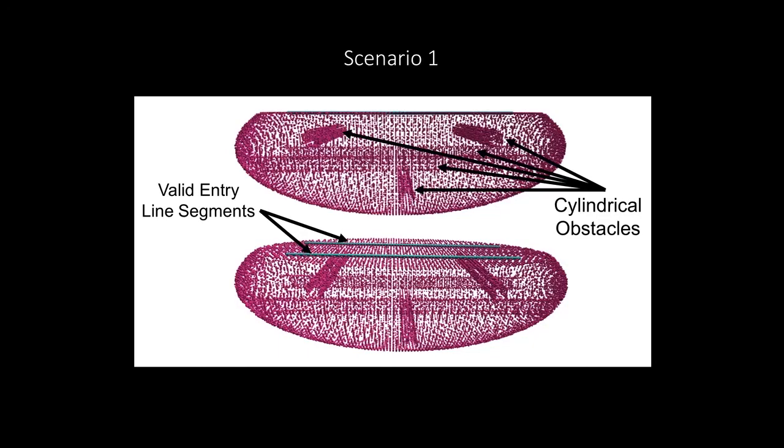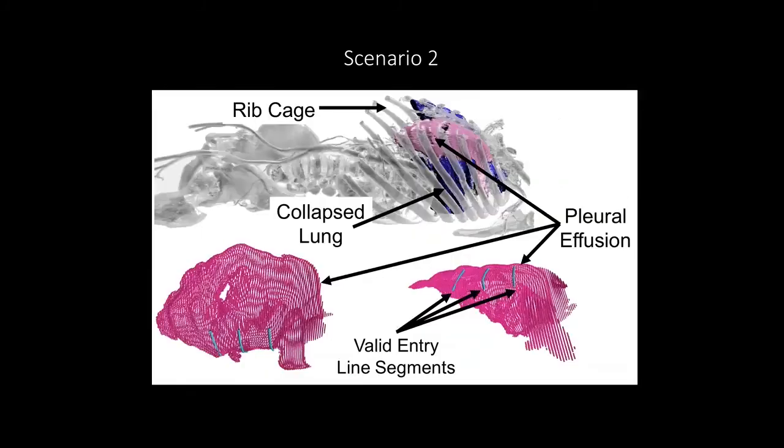We evaluate our method in 2 scenarios. In the first, we consider an ellipsoidal volume with cylindrical obstacles. In the second scenario, we consider the case of visualizing the interior surface of the pleural effusion. Here we segment the effusion volume from a CT scan of a real patient with this condition and consider the optimization of CRISP robot designs in order to enter the volume in between the patient's ribs and visualize the space.